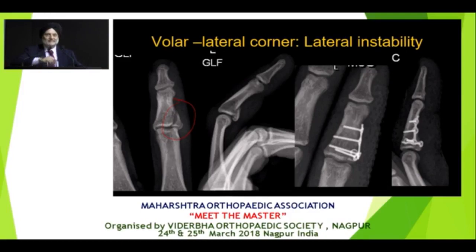One last question. What about hemi-hamate graft, autograft for the P2 fracture? The hemi-hamate graft is something I use when they have come 30 days plus. If it's about a month old, like that patient I did there, and the fragments by then are totally resorbed, then I will use a hemi-hamate graft. We take a piece of bone from the dorsum of the hamate and put it in there.